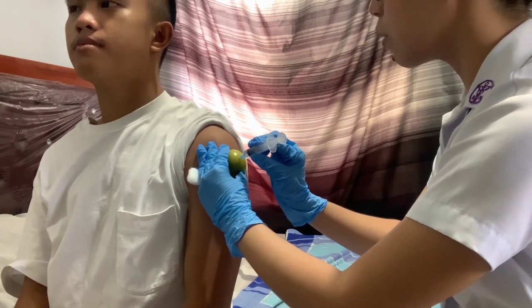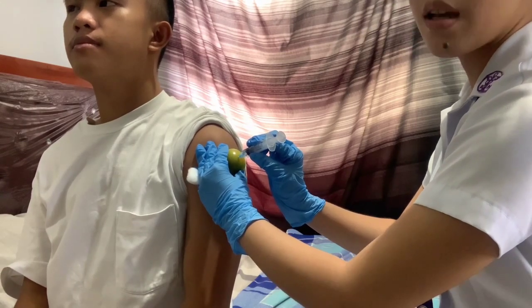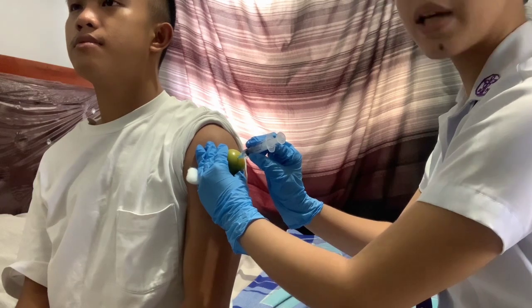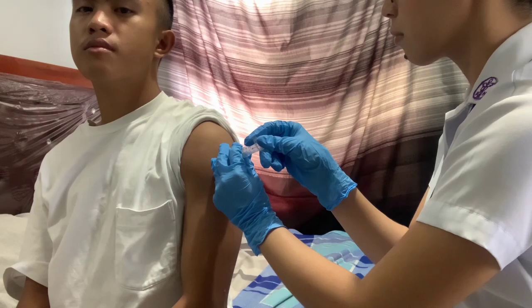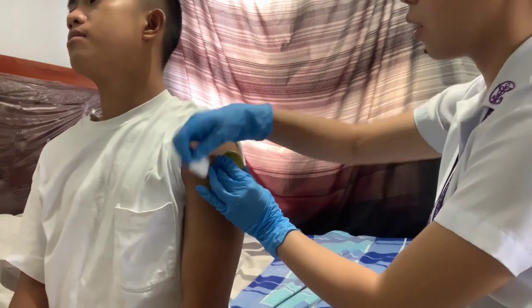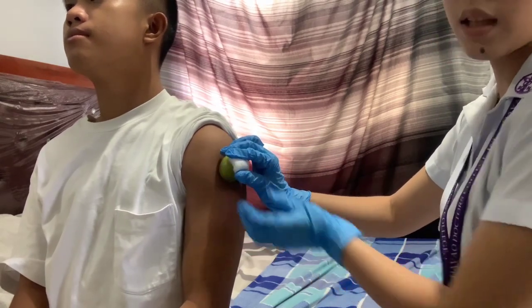just like that. And then we are going to hold the barrel steadily with our non-dominant hand, and then we are going to aspirate using our dominant hand by pulling back on the plunger, aspirating for 5 up to 10 seconds. And thereafter, we are going to discard the used syringe. So now I'm going to place the alcohol swab right into the site.